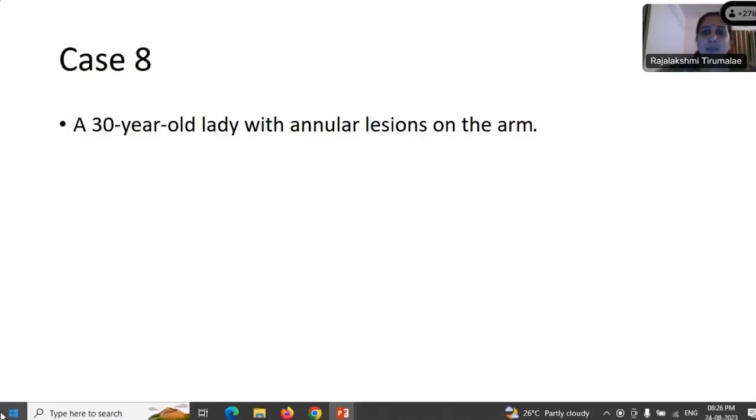So the key in tuberculoid leprosy is to get a good, adequate biopsy that includes the subcutis so that you can evaluate the neurovascular structures very well. But nevertheless, there are always cases where you don't find nerves at all. And yet the pattern is what helps you, of course, with the clinical correlation.